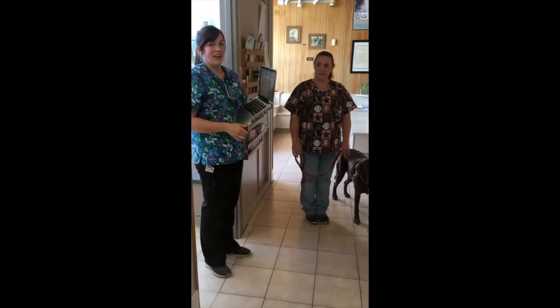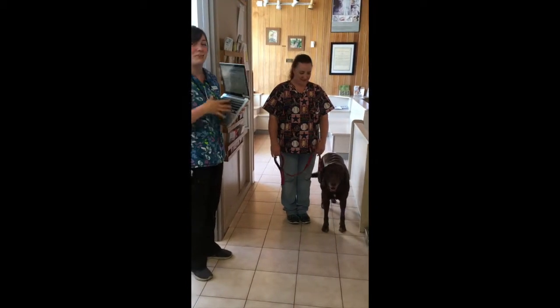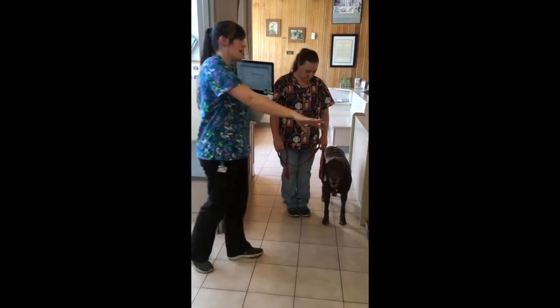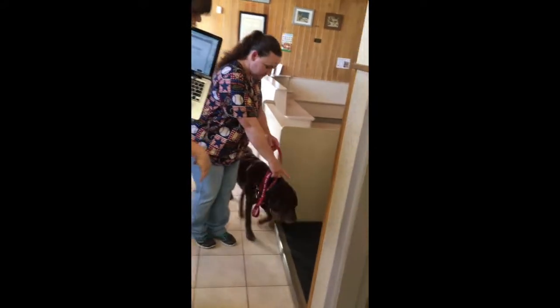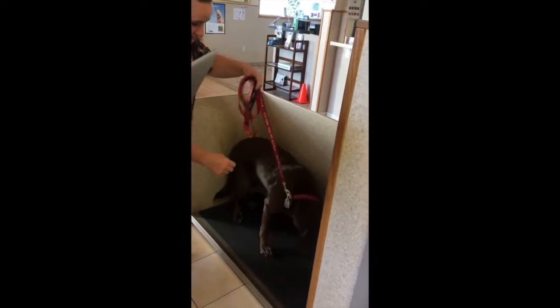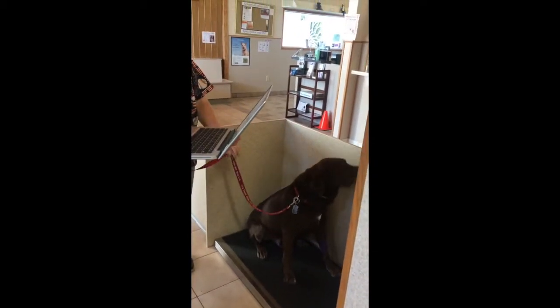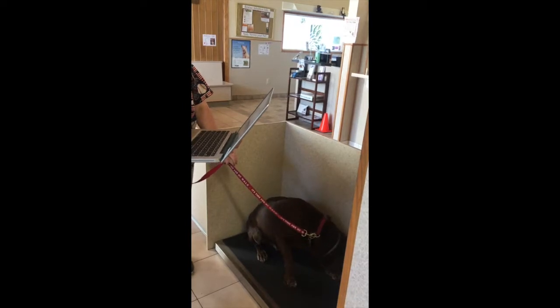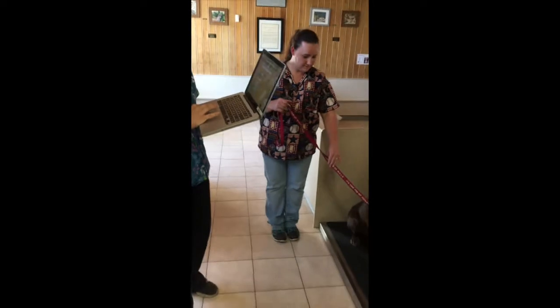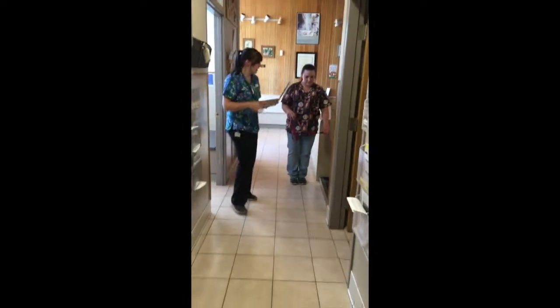Alright, this is Ruger, and we're going to be doing a comprehensive exam on him as if a patient were to come in to see the doctor. So the first thing we want to do is get a weight here. I'm going to have Lisa put him on the scale. Sit. All right. So his weight today is 77 pounds and 3 ounces, so I'm going to go ahead and put that into his SOAP exam.